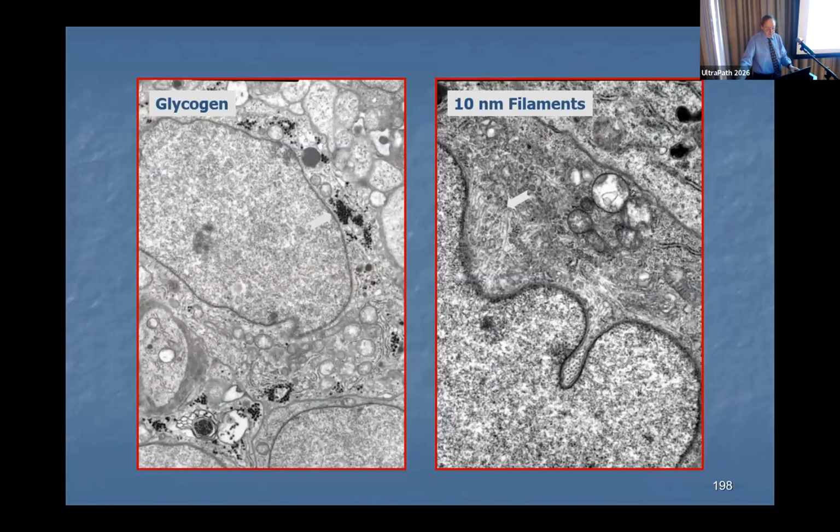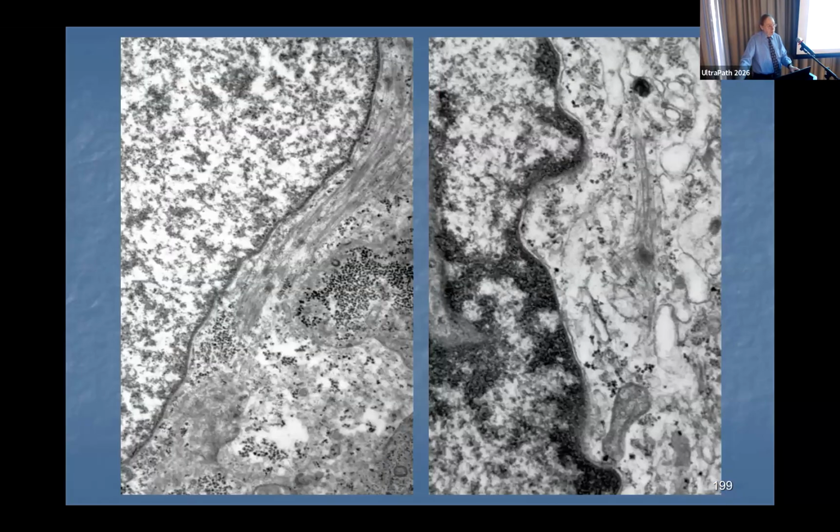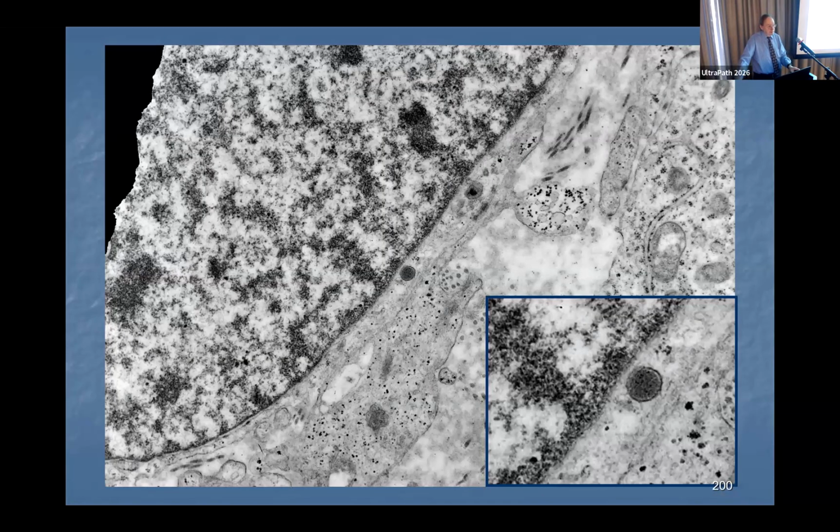And there's some glycogen in there. There are a few little filaments in here, not very impressive. But as we went on to look at other cells, we found areas that have myofilaments with some Z-band material in them. So we have cells that look like they have Ewing's type of character, others that look like they're trying to be rhabdomyoblasts. Then we look around a bit more.